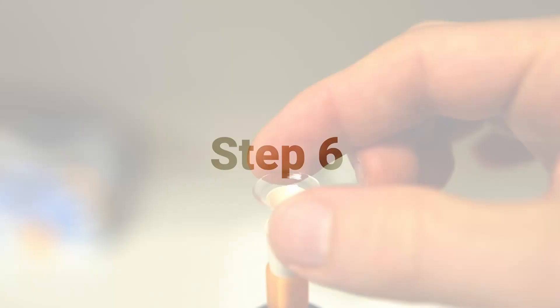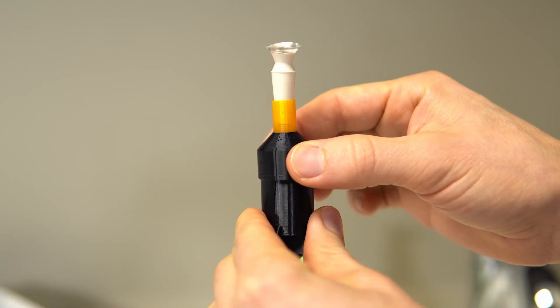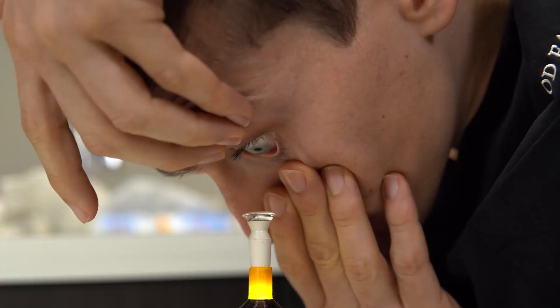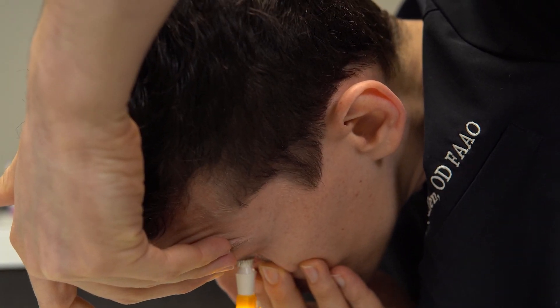Step six: for your second eye, repeat the steps we covered to prepare your lens for insertion, turn on the light unit, and repeat the technique shown for how to bring your eye to the lens.